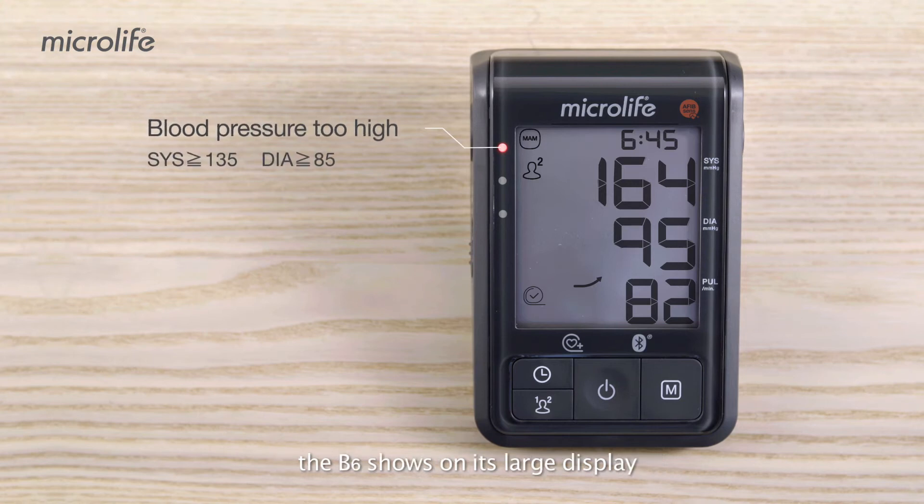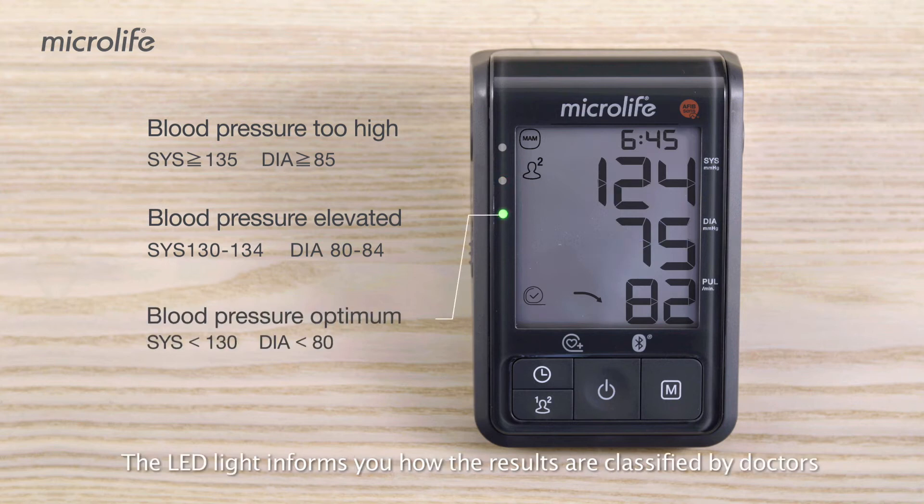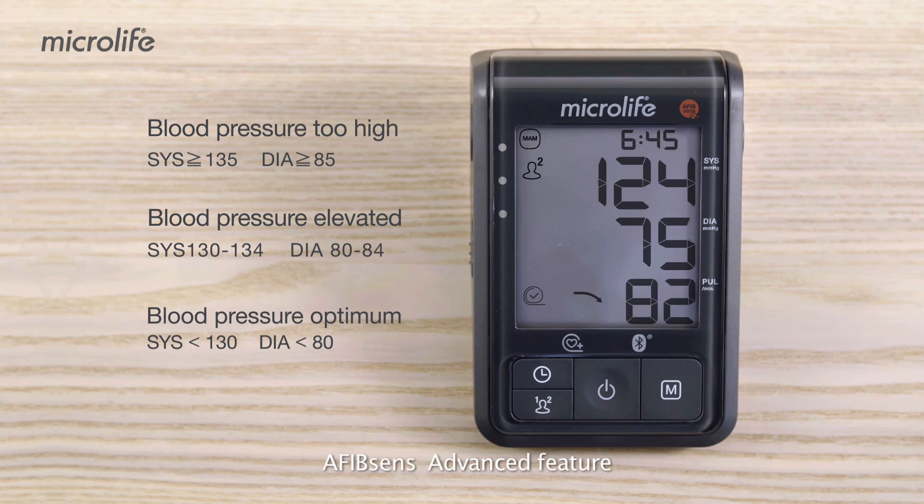When the measurement is completed, the B6 shows on its large display your systole, diastole, and pulse. The LED light informs you how the results are classified by doctors.